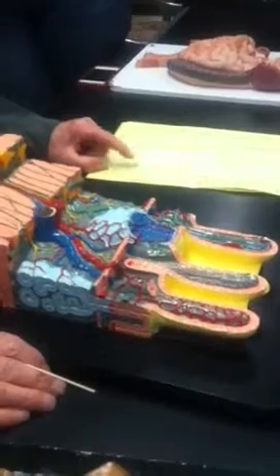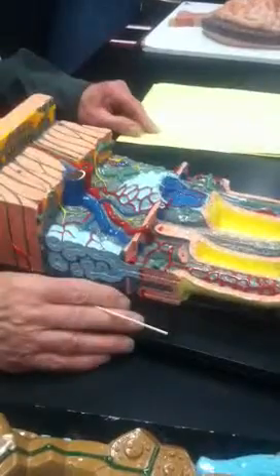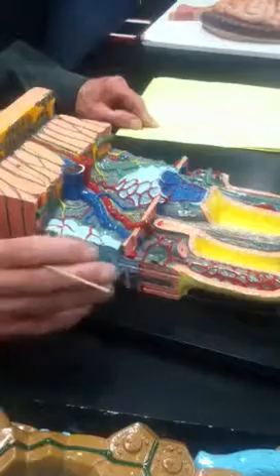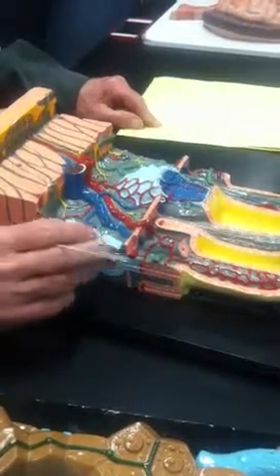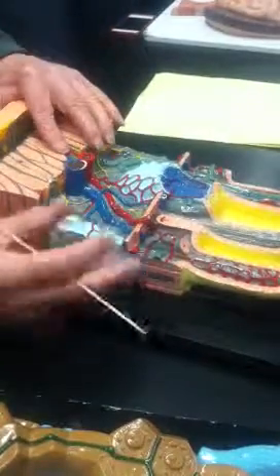Then we have Brunner's glands. That's one of the glands that secretes material that contains mucus and contains stuff to neutralize acids and digestive. They have a more specific function that I don't want to get into. Maybe your lecture will. At any rate, all this stuff right here, as well as this stuff here, that's Brunner's glands. So don't get confused by the color of the lymph node and the color of the Brunner's gland, which is the same. Okay, make sure you know this is lymph node because you see the lymphocytes inside, and this is Brunner's glands.